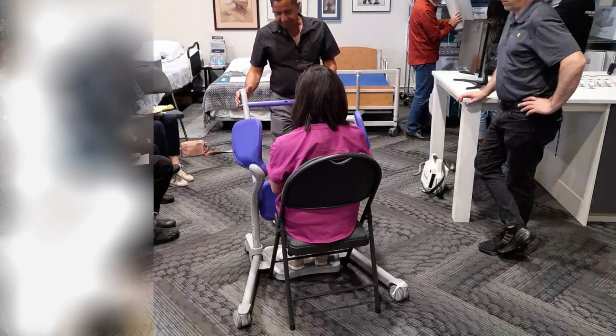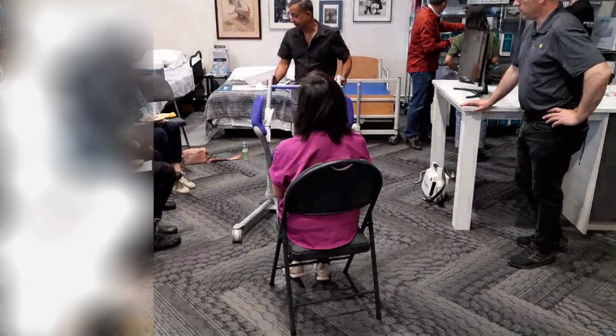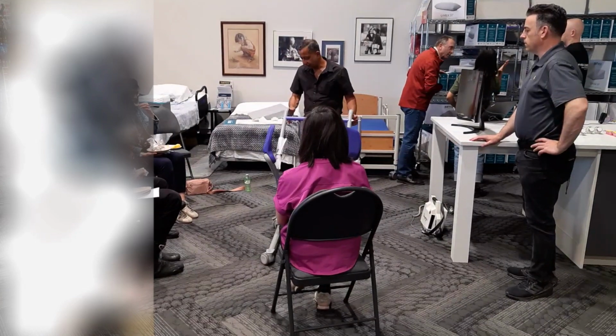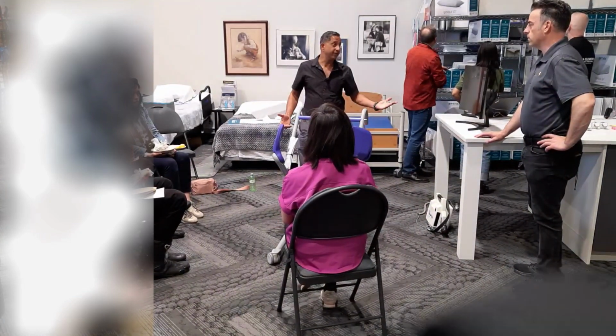Again, the advantage is it's a mechanical device. Nothing breaks down. Because the biggest problem is if something breaks down, you have to call a technician and everything else. Here, the only thing you need to do is maintain the casters. Maybe after 5 years or so, clean the casters or replace them if they're not functional.